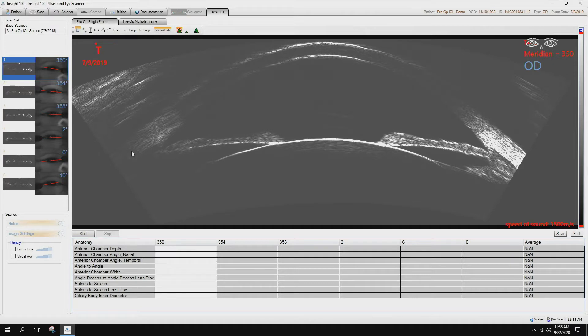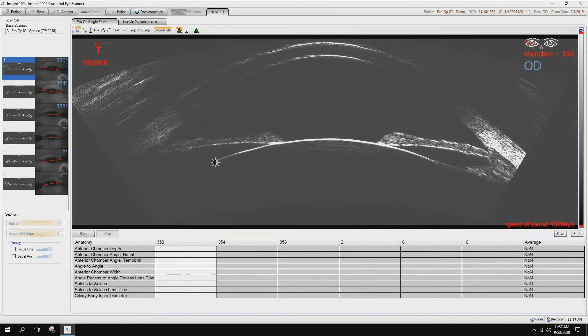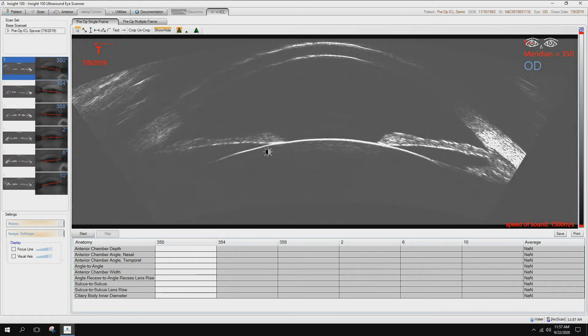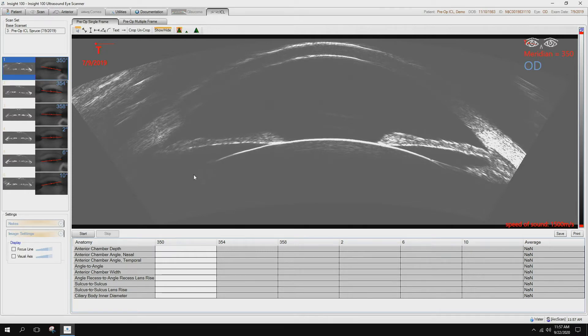Now what I'm looking for is making sure that I've adjusted with the right mouse button holding it down. I can brighten, I can change contrast, and what I'm trying to do is highlight the various structures within the eyes so that I can clearly see them to take measurements. It is clear in this image that the temporal side, I am not able to see the ciliary body, so that would be a measurement that I would not take on this particular patient.